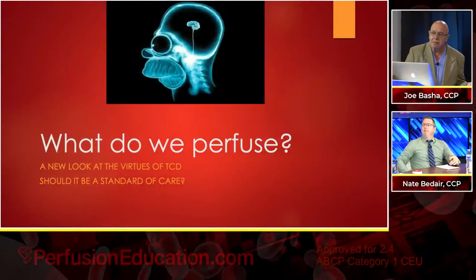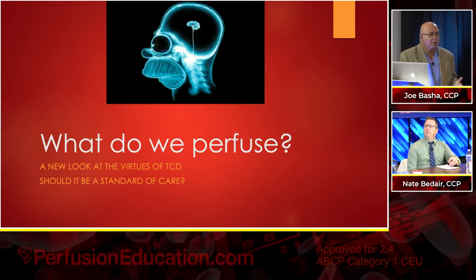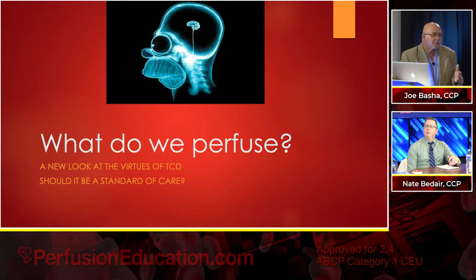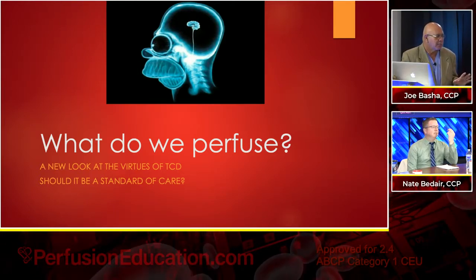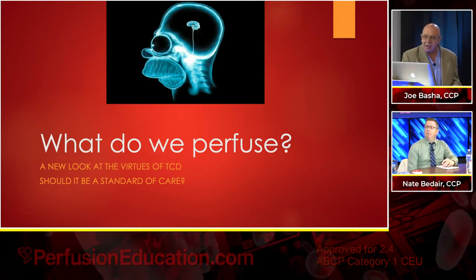What is it, Nate? I'm going to put you on the spot again. What are we here to preserve? When we go on cardiopulmonary bypass on the pump, everything is important, I understand that. But what's the most important, the most sensitive, the biggest worry we have? The brain. Not the face, the brain. We're worried about the brain.